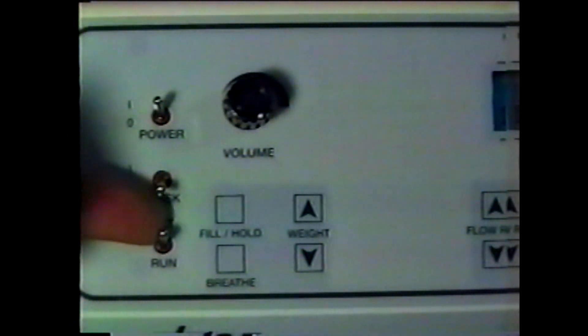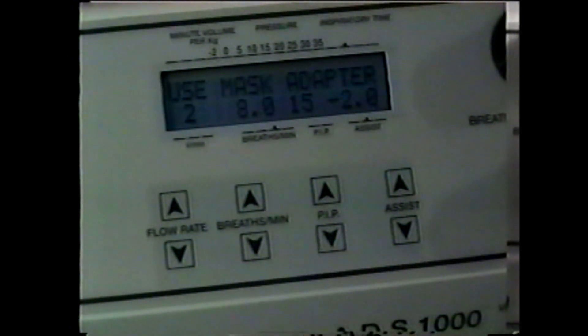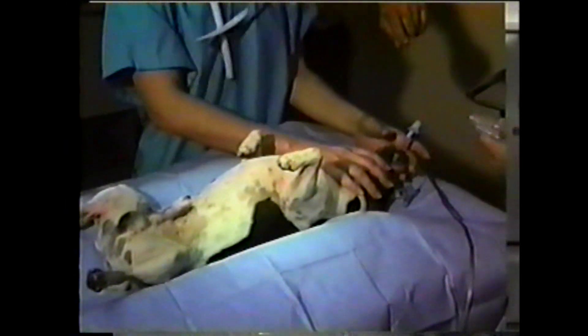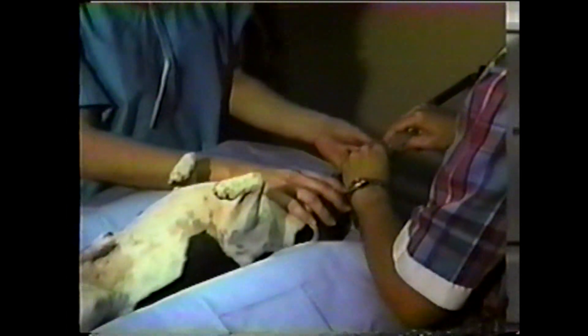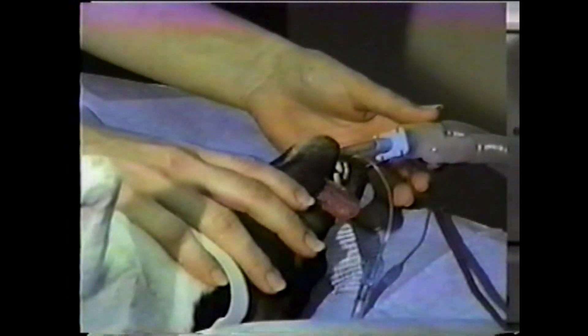If you use the ADS for mask induction, push the mask switch to the up position. The display will read mask mode on. Follow the masking instructions in your manual. When complete, switch the mask mode off. After the patient has been intubated, connect the breathing circuit to the intubation tube. Make sure that the cuff is properly inflated and that there are no leaks.